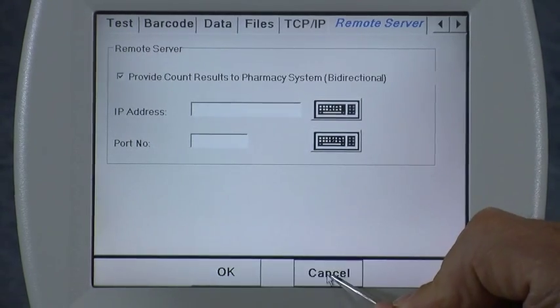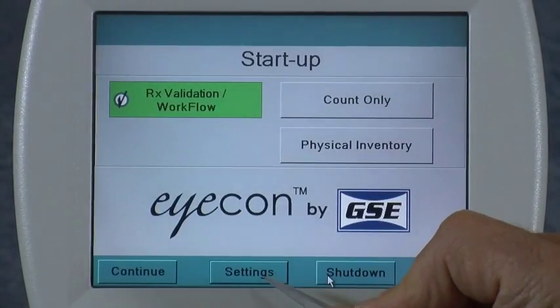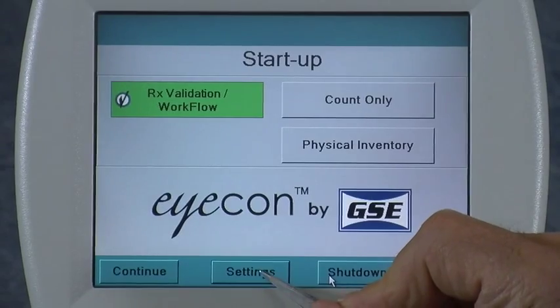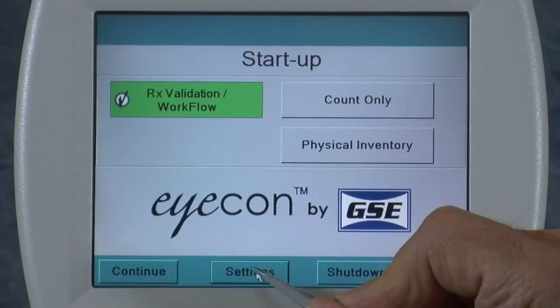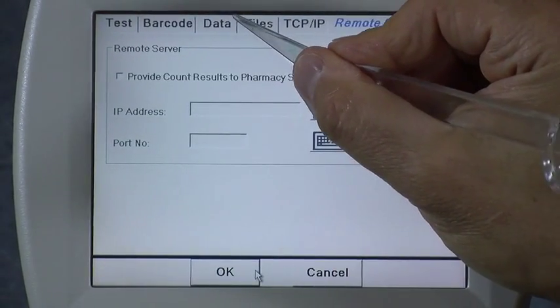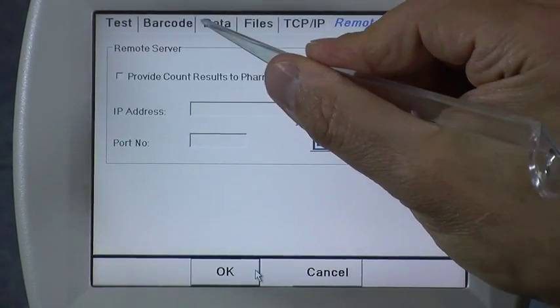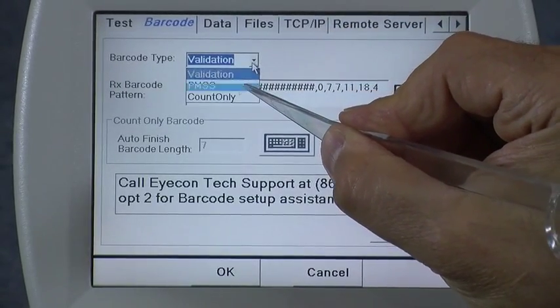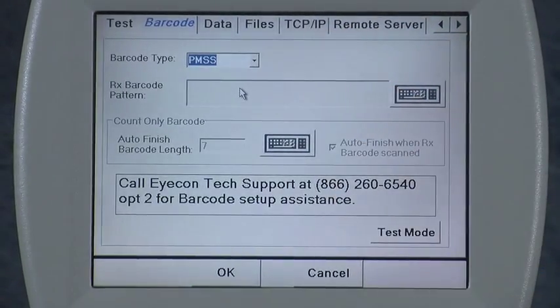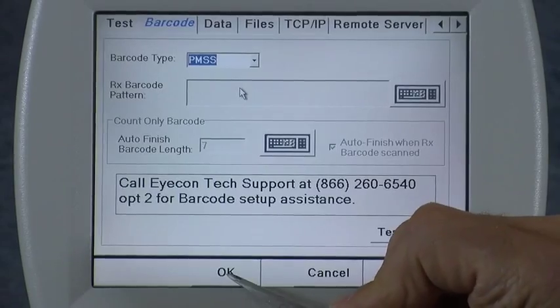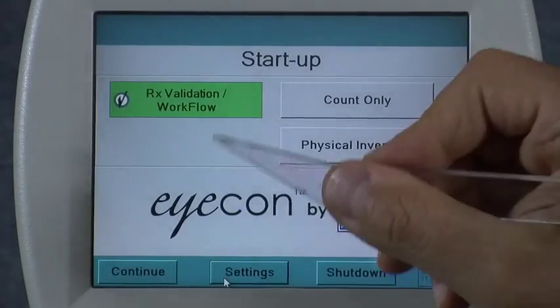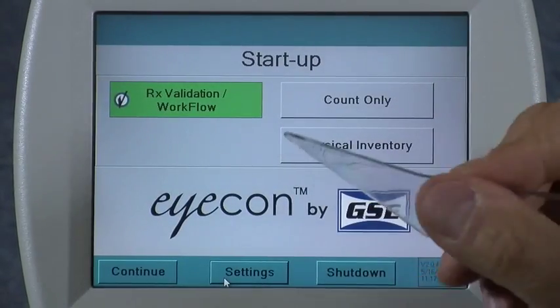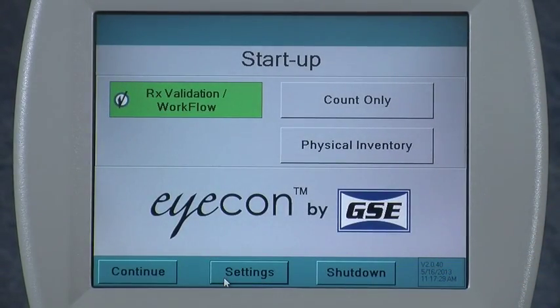Next, to complete the setup for the pharmacy management system, go to the Barcode tab and specify PMSS mode. Then press OK after making all these changes in order to save your settings. This completes the setup for interfacing your icon.